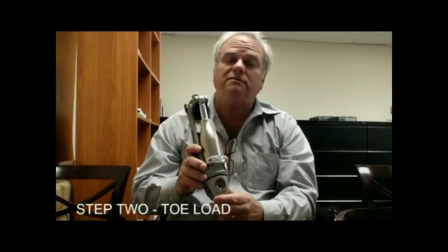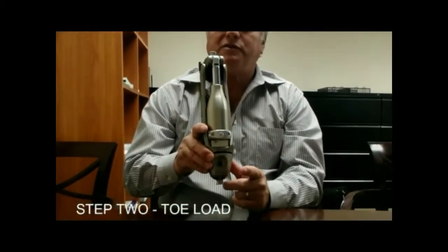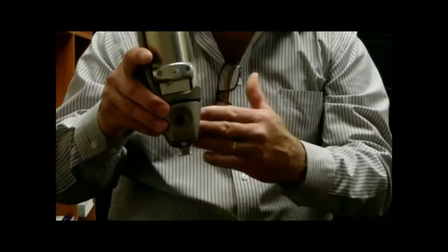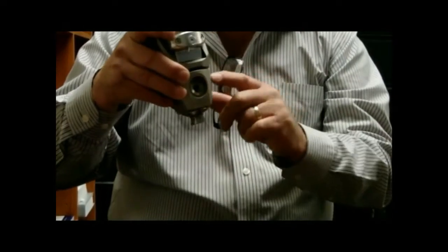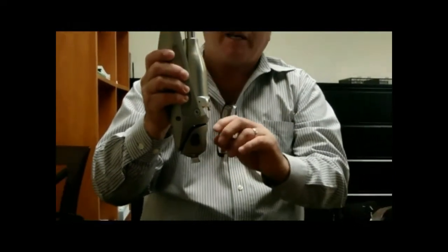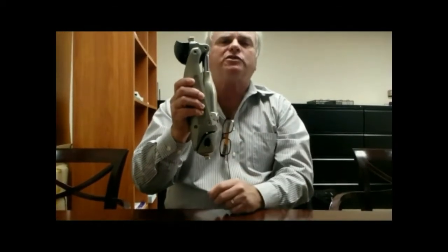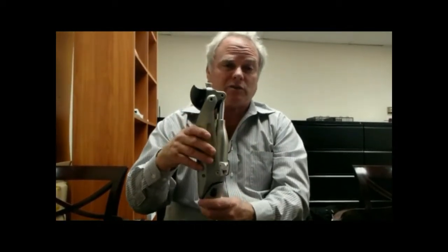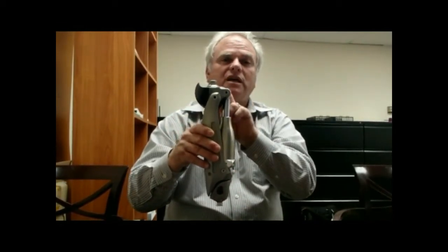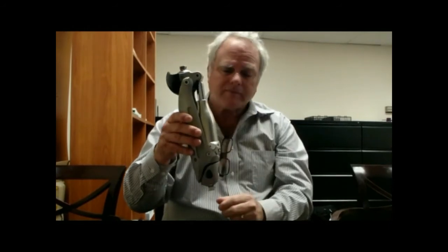The first thing you want to do with the walk is if they trigger the knee and they get it into swing, excellent. If they don't trigger the knee and they can't start swing, you back off this big screw down here. This bumper adjusts how much force the toe lever of the foot gives to initiate swing. It's simply a switching mechanism down here, and as you back it up, it makes it easier for it to switch into swing. It needs two things to switch. One is a toe lever to move the switch, and the other is full extension of the knee.